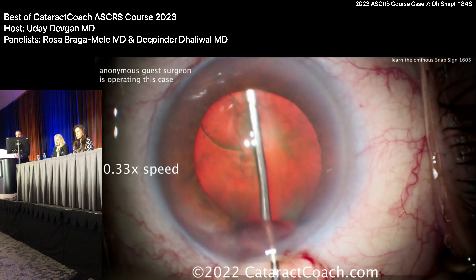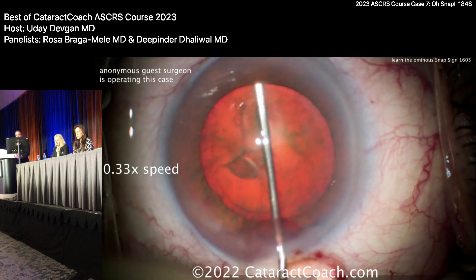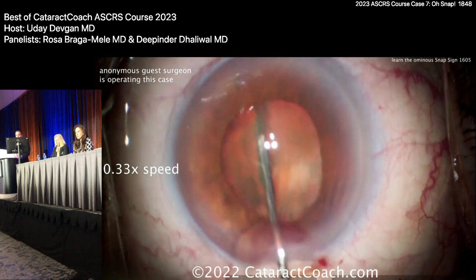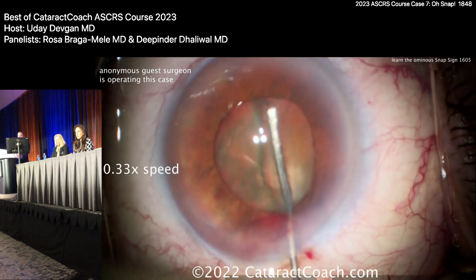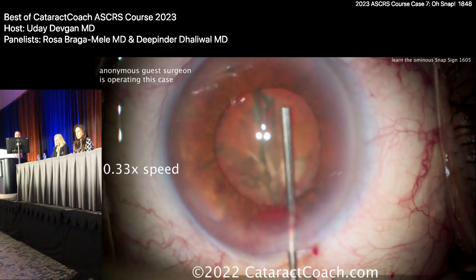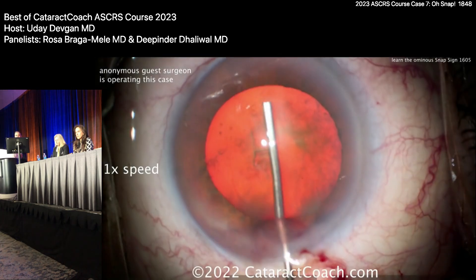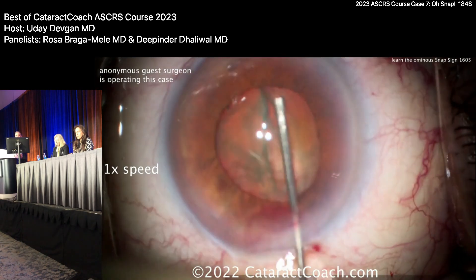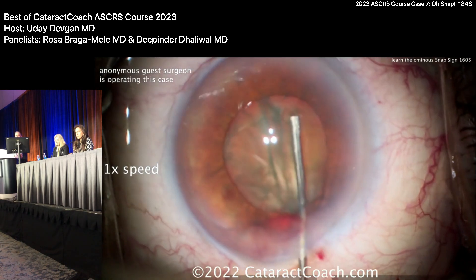There's the hydrodissection with the fluid wave going around. The cannula is right there on top, preventing the nucleus from coming up — and then: snap, like that. One more time at regular speed, just so this is absolutely hammered home and you never forget it for the rest of your career. Regular speed again — ready — and snap, boom.